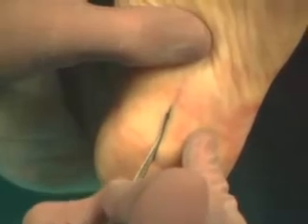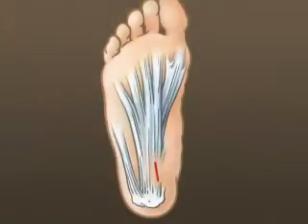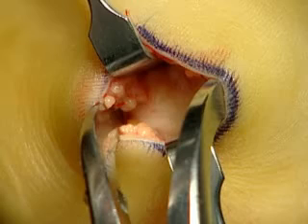Create a small incision, medial, approximately 1 inch, over the area of maximal tenderness, commonly over the medial slip of the fascia. Incise when appropriate to expose the involved fascia.